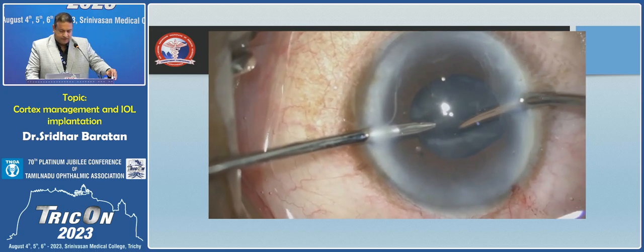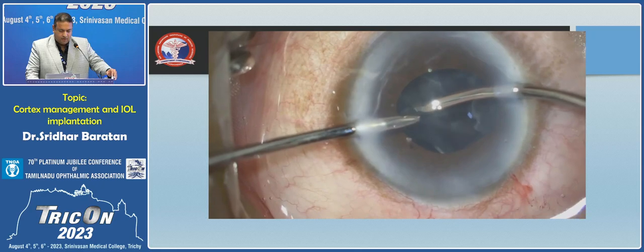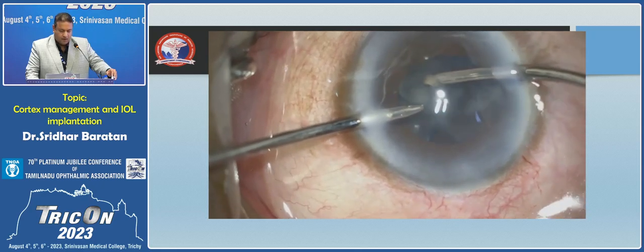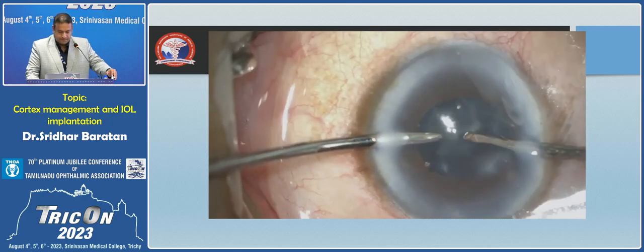You can see that, even though it's slightly thick, with adequate vacuum, you can actually get the entire epinuclear plate also out with irrigation and aspiration.